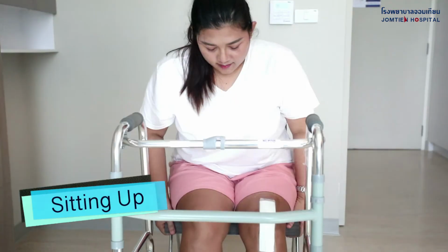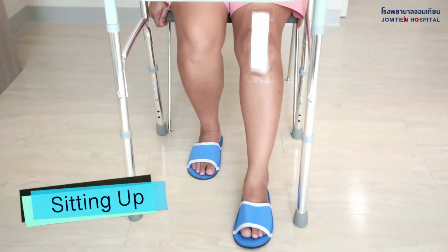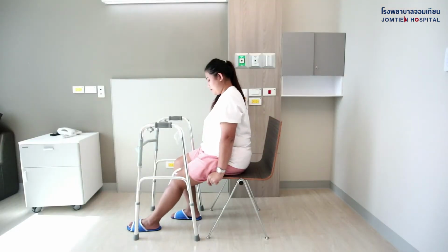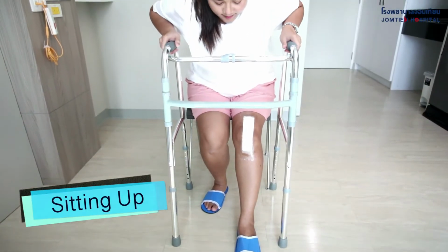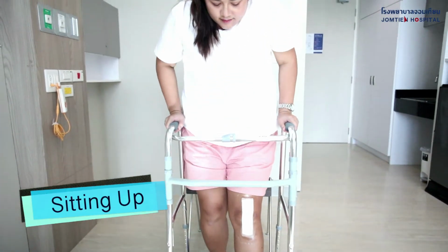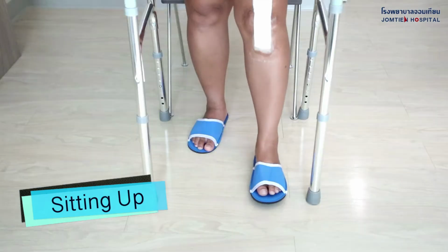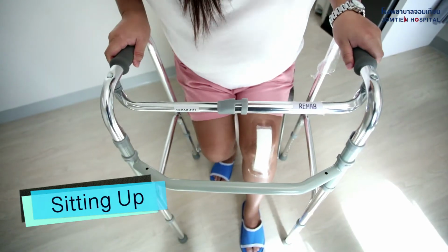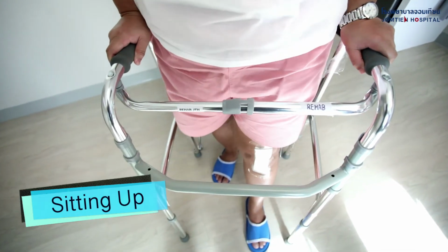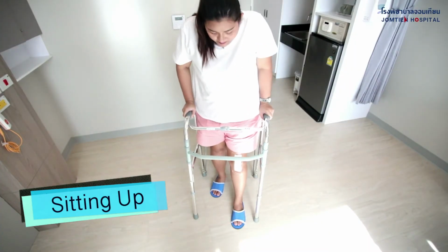Sitting up. While sitting down, move towards the front. Stretch out the surgical leg. Use both hands to hold the full-legged walker. Move toward the front, stretch the surgical leg, and put the weight bearing on the non-surgical leg to stand up. Once you are up, move your surgical leg to a normal standing position by taking as much weight as the surgical leg can handle.